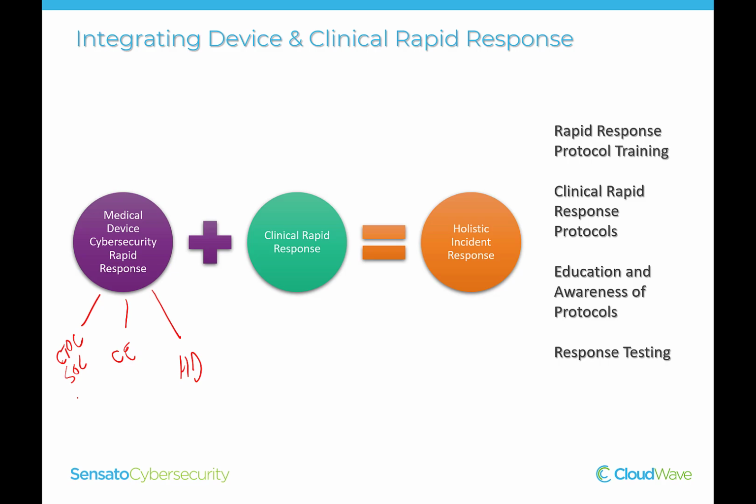You want to put this group, both your initial dispatch center, if you will, and your clinical rapid response team through a set of tabletops. So that you can test to make sure that this is all working, that everybody understands their role and how this smoothly works. And there's a whole bunch of other things to understand, right? There are certain things that the clinical rapid response team needs to be educated on in terms of security, right? And they need to be made aware of why this is important. So there's a bunch of stuff there, but again, the idea about this chalk talk is to get you thinking and really help you drive to a new level of preparedness.